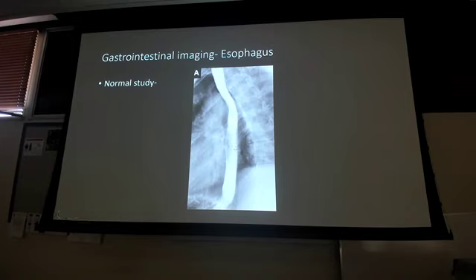So when I squeeze the barium down, and if I take a shot right as it happens to open back up, there's going to be a little bit less density there because I just pushed it out and I'm waiting for it to get coated again. So there's multiple pictures and multiple x-rays that happen with this exam. This is just one example, okay? So you're looking for the nice smooth edges, the nice tubular kind of structure coming all the way down here, highlighted with the barium.